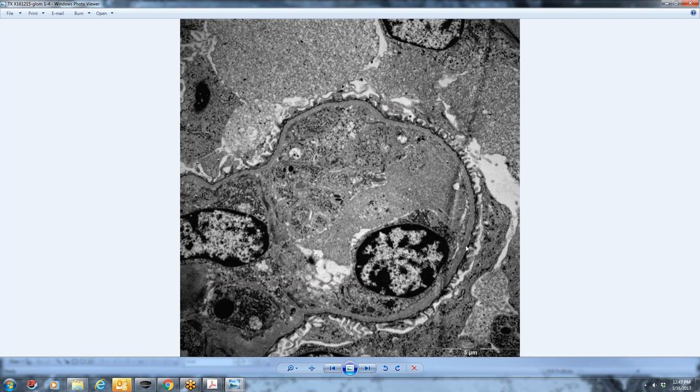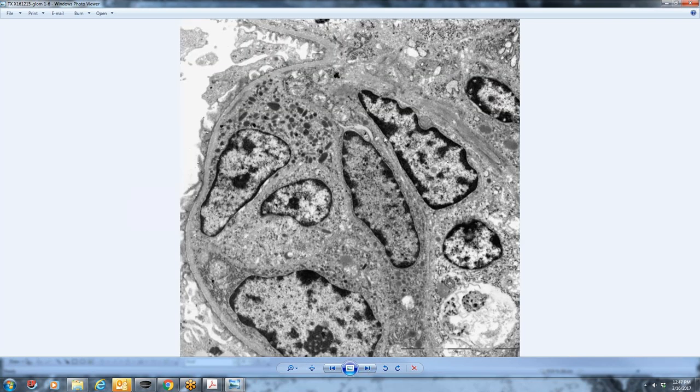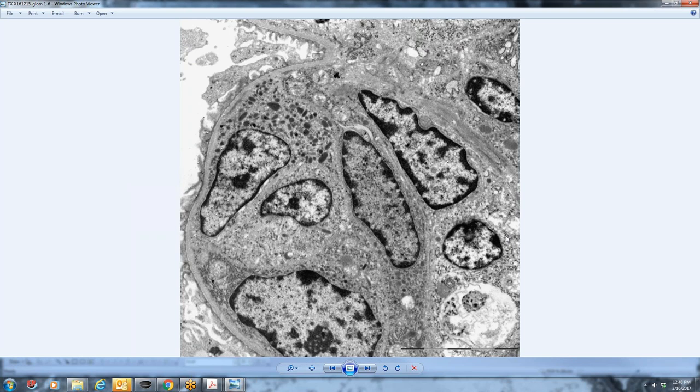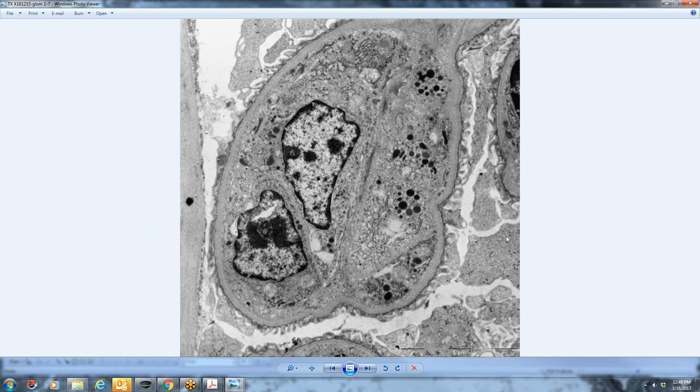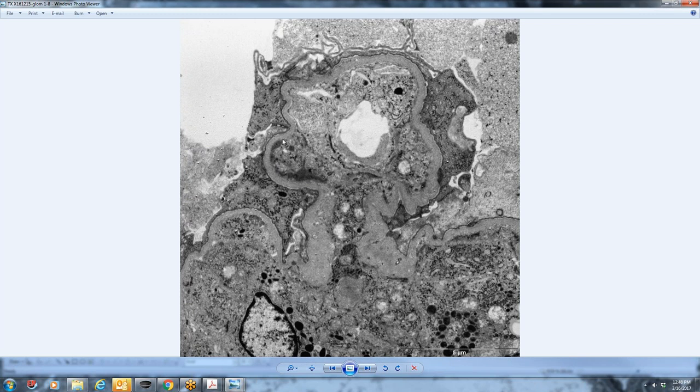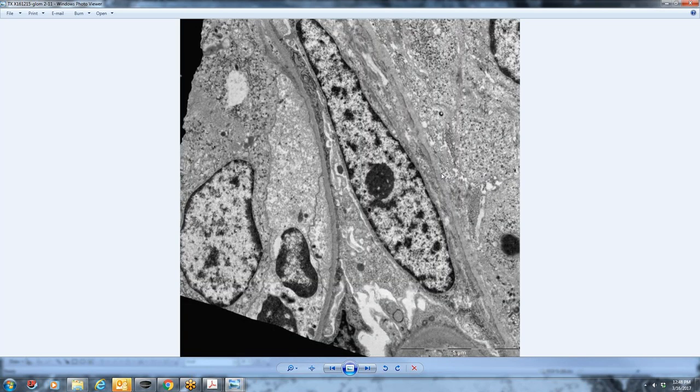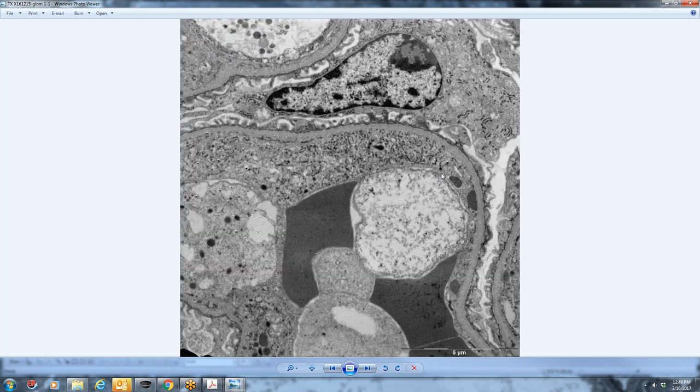But this is just constant throughout all the capillaries, where we have pretty good podocytes, a pretty good GBM, and then everything hanging out here in the capillary lumen. This is definitely a granulocyte here because of our cytoplasmic processes and the shape of the nucleus. So I wasn't really sure what to do with this particular case. This isn't possibly an immune deposit. It's definitely electron-dense material. It gets hard to say right when it's at this neck region whether or not it could just be hyalinosis. I would favor that it's an electron-dense deposit, but it's hard to say.